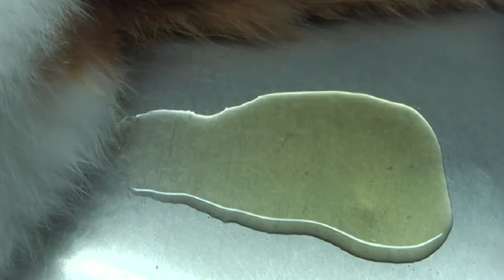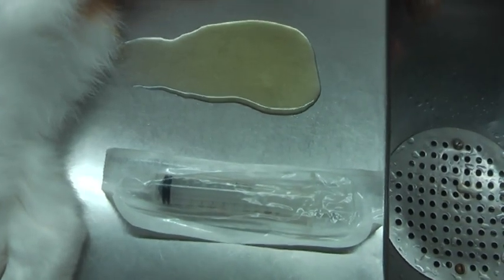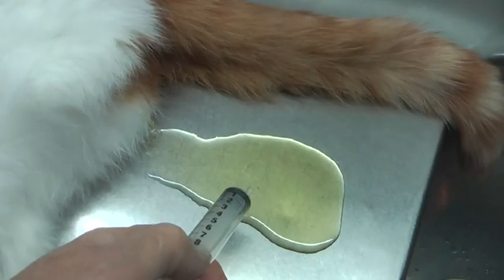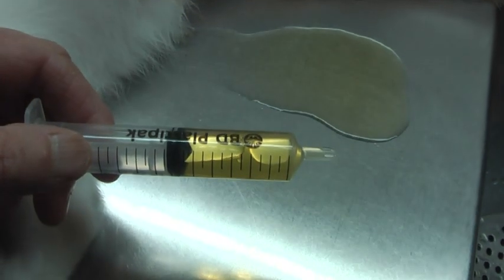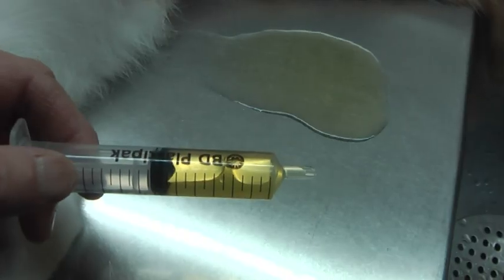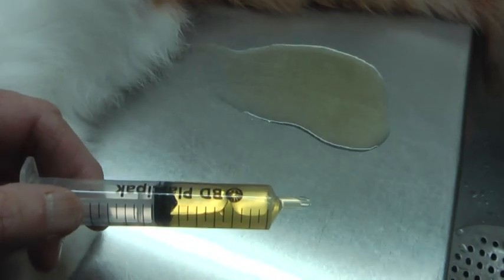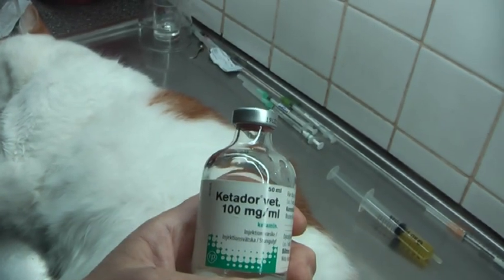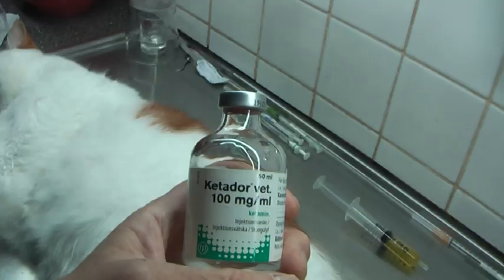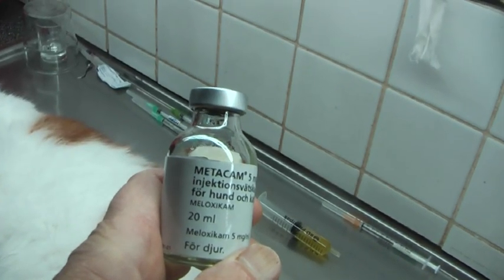No blood. I'm going to take a sample like this. I can check it for bacteria or crystals — bacteria, sediment. Anesthesia is necessary in this case for pain management.